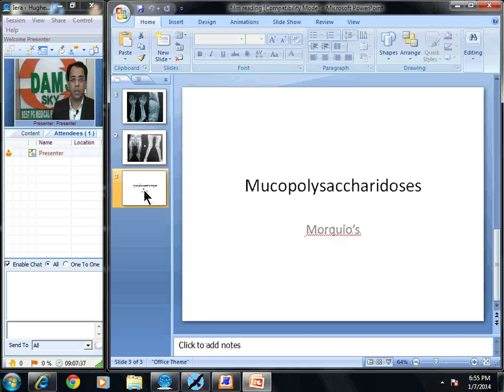So the case that we had today for your discussion was mucopolysaccharidosis, and it is possible to diagnose metabolic conditions on plain films.